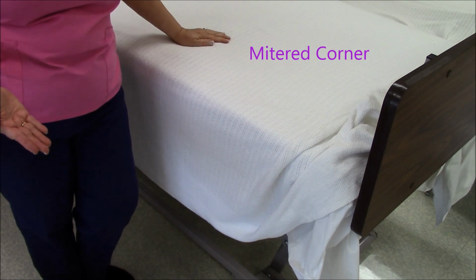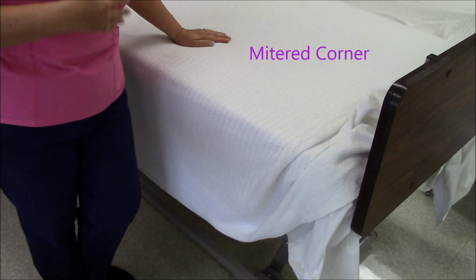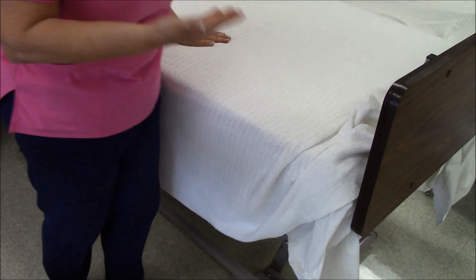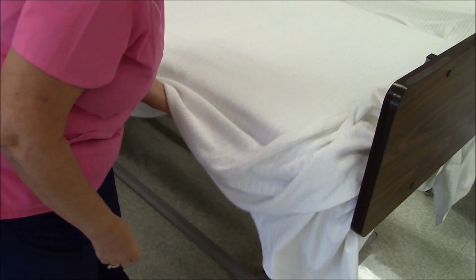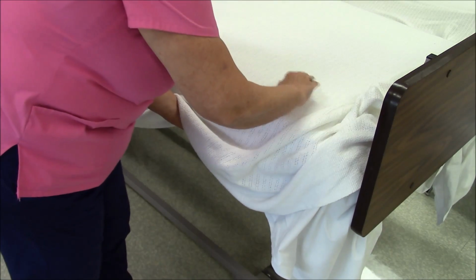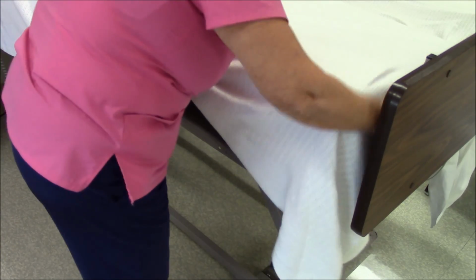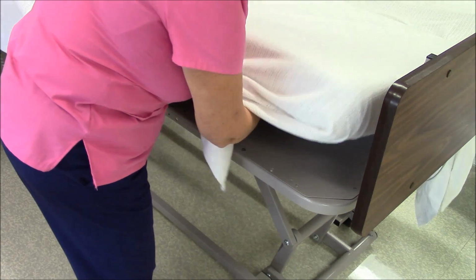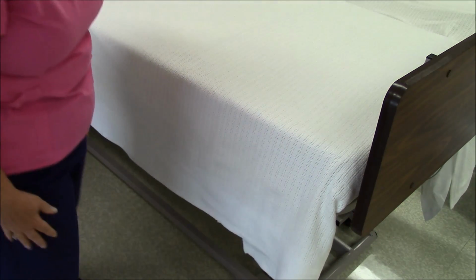The purpose of the mitered corner is to make it a well-made bed that doesn't easily become undone for your patient or resident. One of the first steps in making a mitered corner is I like putting my left hand underneath the mattress and I just have better control. You are going to take your bottom sheets and blanket together and you're going to tuck it into the bottom of your mattress and just swoop your arm through and have the linen hanging.